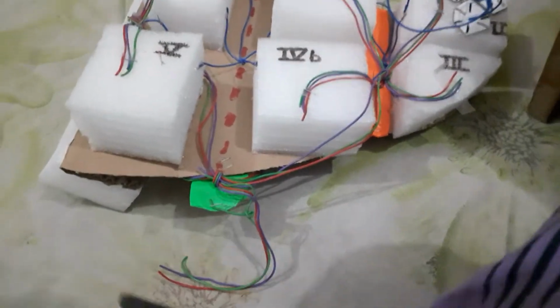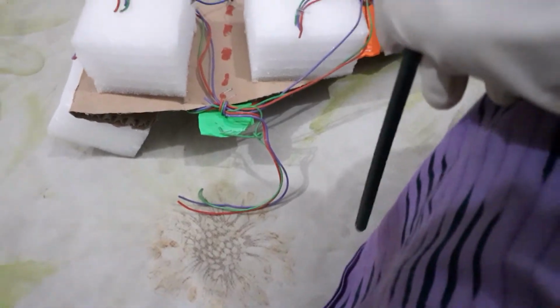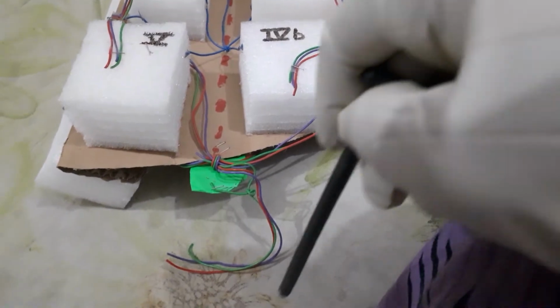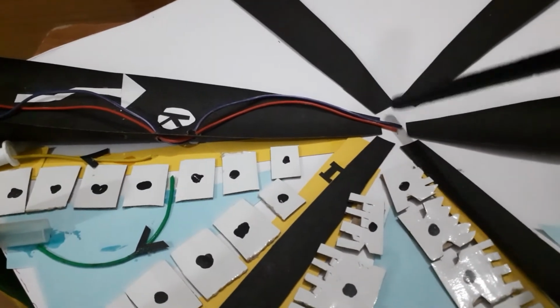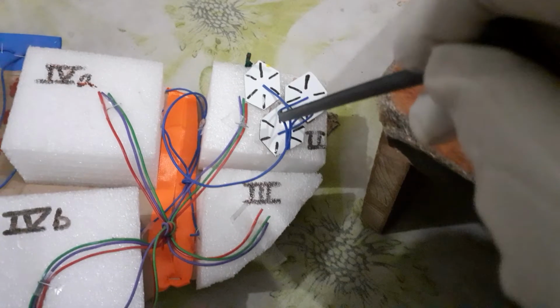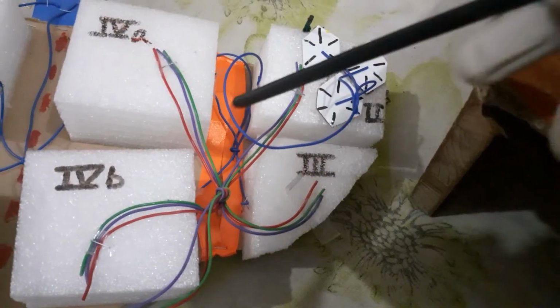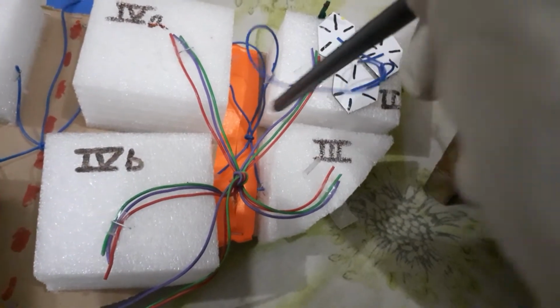And how does the blood enter? The blood enters from the whole of the GIT, spleen and the pancreas through the portal vein, and from the abdominal aorta, the hepatic artery. All these vessels come into the sinusoids, then go into the central vein. This is the central vein. These central veins unite to form the sublobular vein. The sublobular veins from all sides unite to form the hepatic vein.